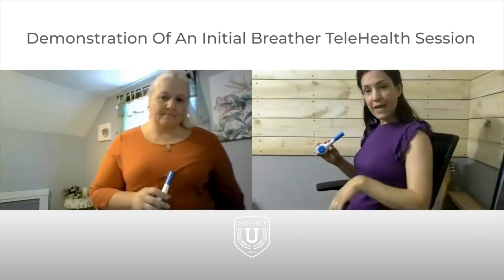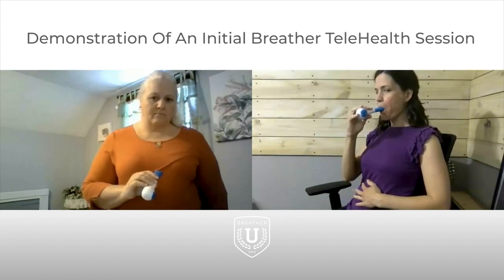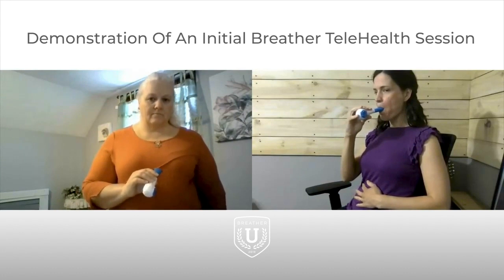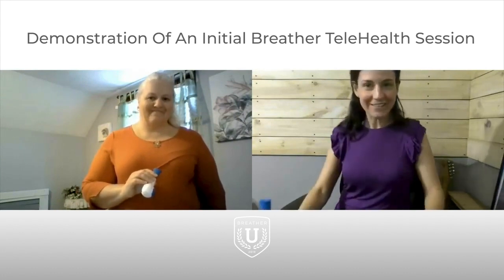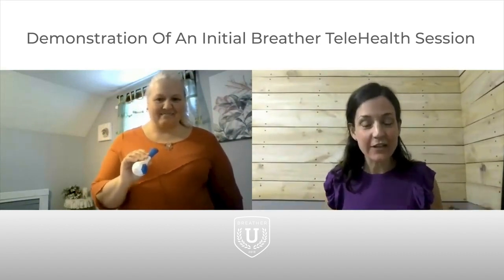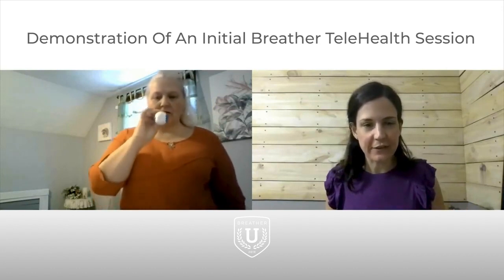We also talked about diaphragmatic breathing. So when we're doing this, we want to make sure we're breathing with the diaphragm. And you'll just breathe in and out through the mouthpiece like this. Could you hear it? Yes. Mine makes a little kazoo sound now on the exhale. That's fun. I would like you to try. Just do 5 breaths. So in and out is 1 breath. Give me 5 nice, easy breaths, and let's see how you feel.